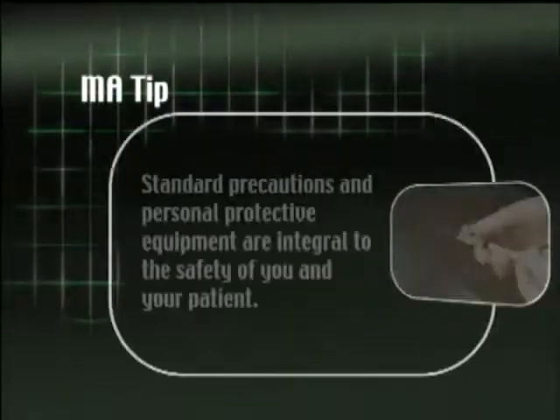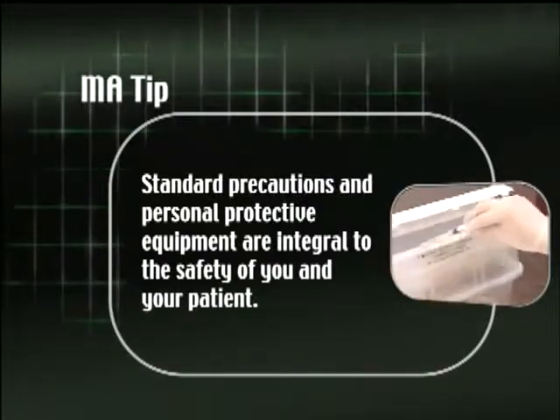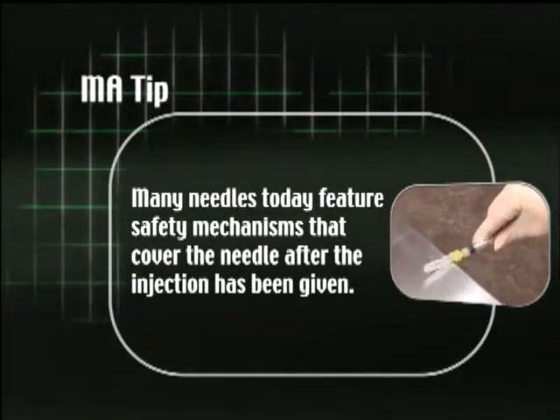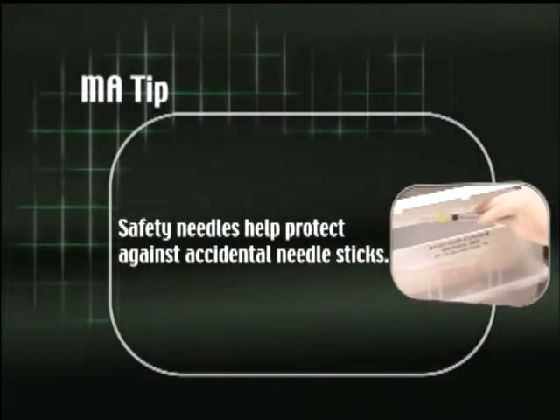Now that you've seen how medications are prepared, let's look at the procedures for administering parenteral medications. MA tip. Standard precautions and personal protective equipment are integral to the safety of you and your patient. Many needles today feature safety mechanisms that cover the needle after the injection has been given. Safety needles help protect against accidental needle sticks.